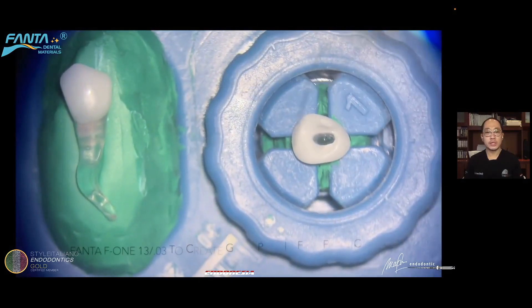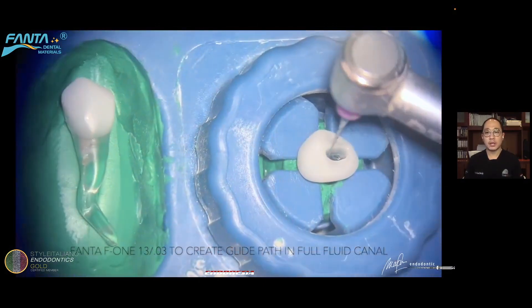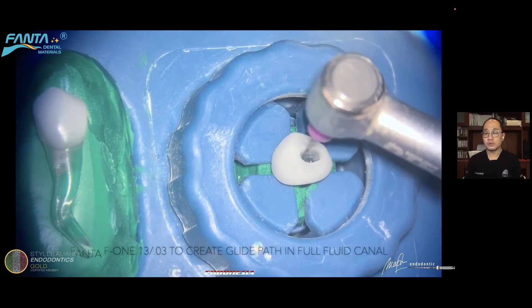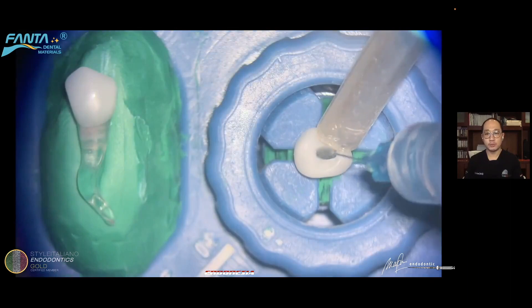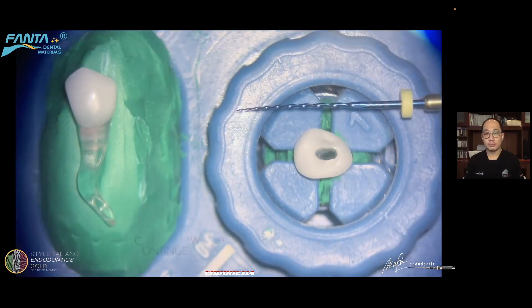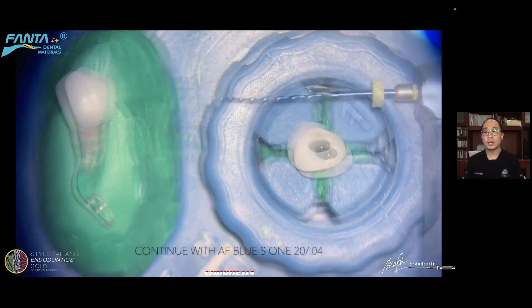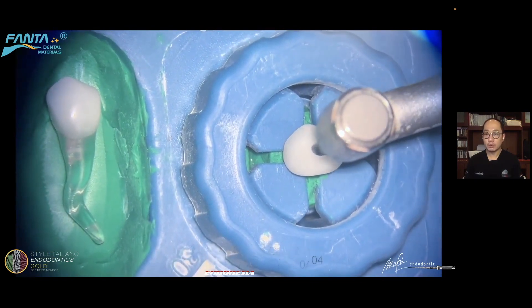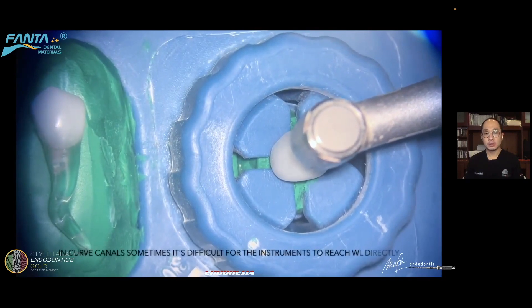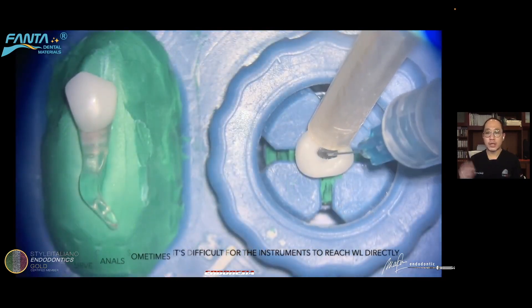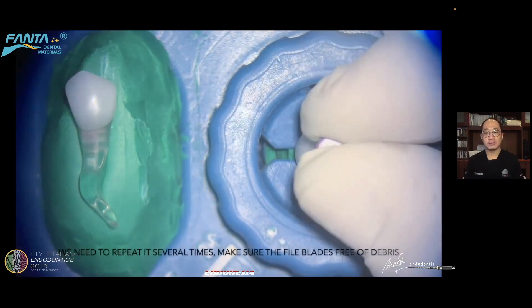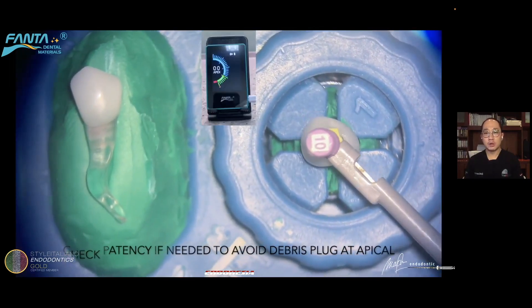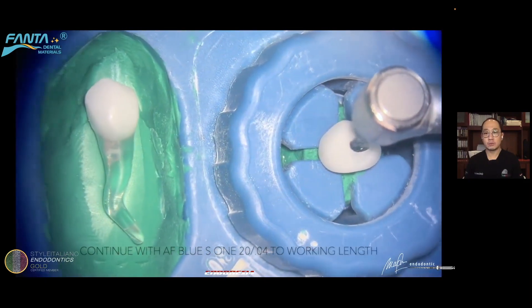Continue to create your reproducible glide path. I use the Fanta F1 13/03 to create a good glide path. When using rotary files, always ensure you have a fully flooded canal with lubricant, followed by copious irrigation to ensure debris is cleared out. After creating the glide path, continue shaping with the AF Blue S1 tip 20 taper 04 until you reach working length. In curved canals, you may not be able to reach working length in one stroke — sometimes you need to repeat it several times, always checking patency and confirming working length each time.